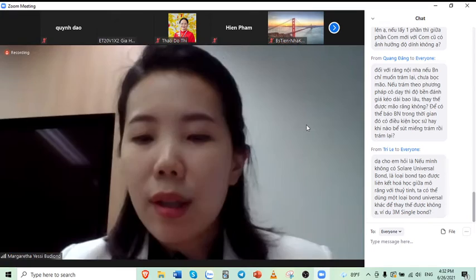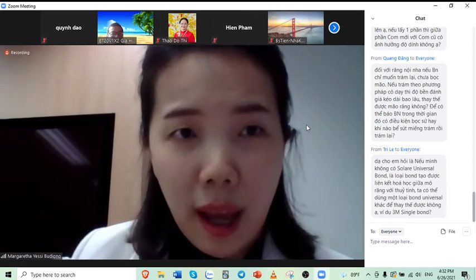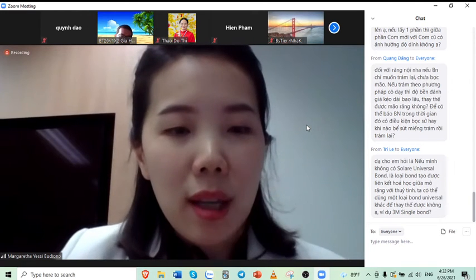The one that I use is Garrison by Garrison. Or there is actually a lot, like Palodent also has this kind of matrix. Then what else? Fit3 from Triodent also have.